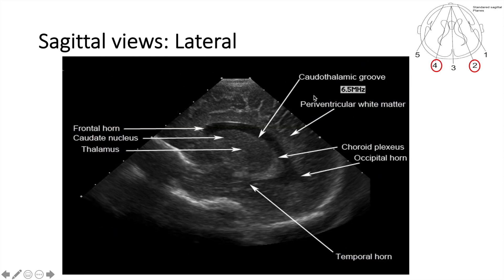When we move a little bit more laterally, whether on the right or left side, we're going to see most of the ventricle. This is a lateral ventricle on one side — this is the frontal horn of the lateral ventricle, this is the occipital horn, and this is the temporal horn. This white area here is the choroid plexus, and this is the periventricular white matter. This is the thalamus, and there is the caudate nucleus here.